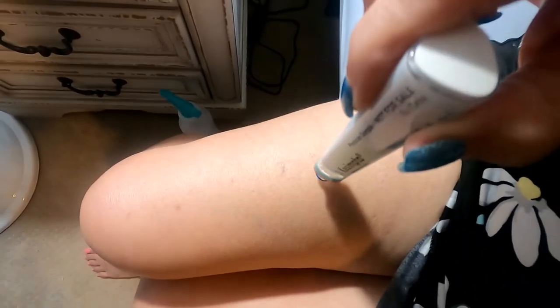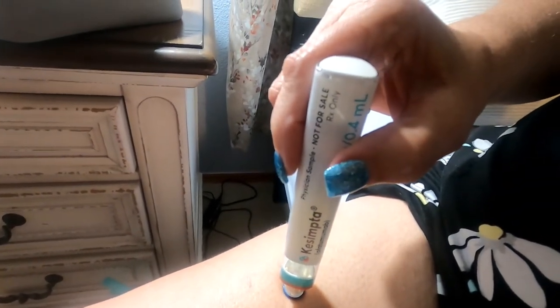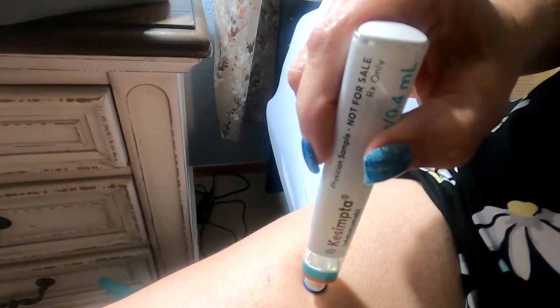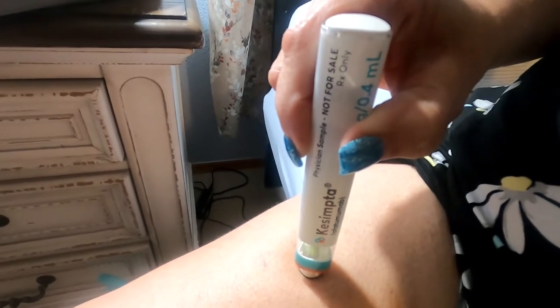So here we go. You press it and you'll hear one click, then a second click. Say 'one one-thousand' and then lift off. Here we go — one one-thousand. Okay, that one hurt a little bit. Wow, that one stung a little bit.